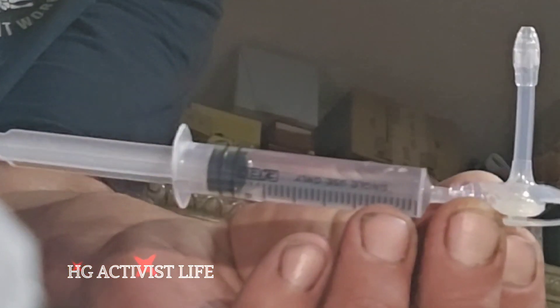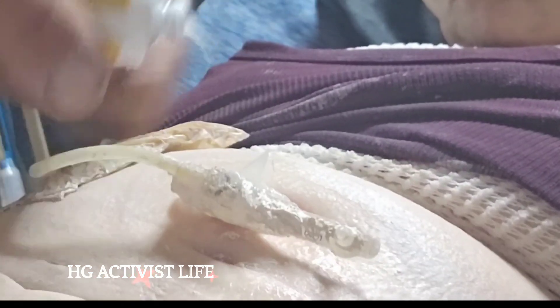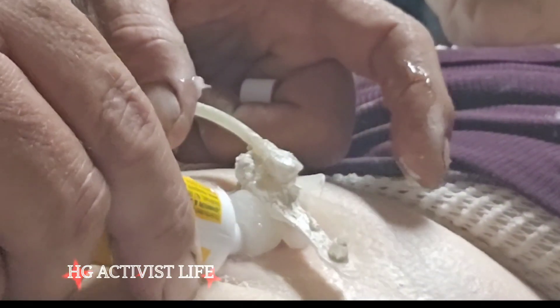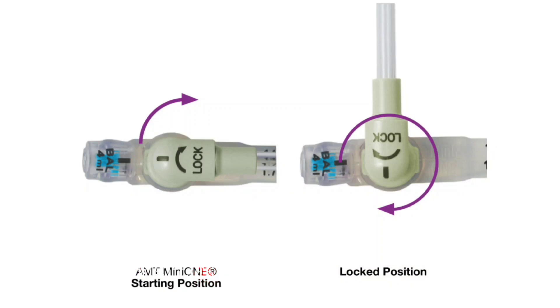You can see Robert putting the Neosporin and caking it all around the tube on each side, because you want to have it lubed up. I'm taking the extension off because the weight on the side is just too much.